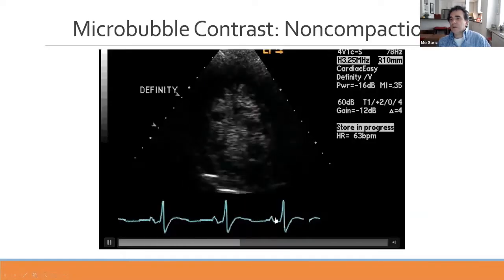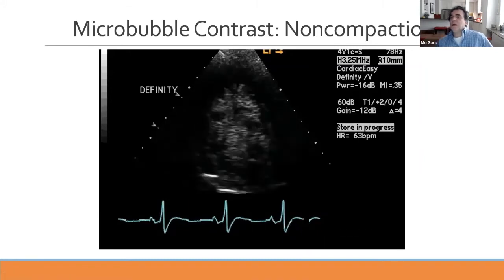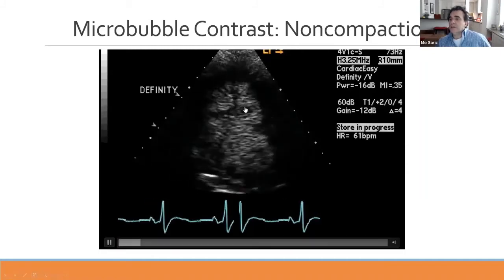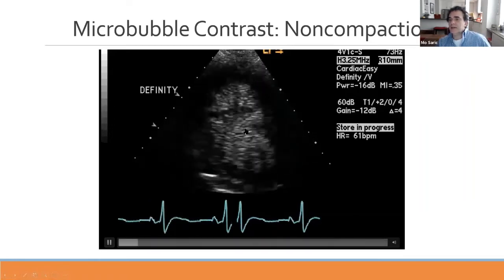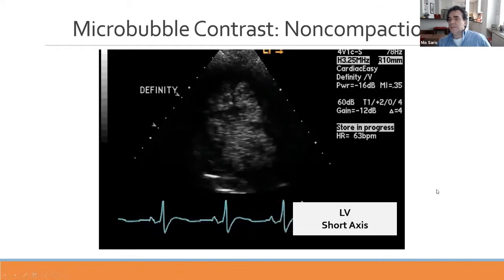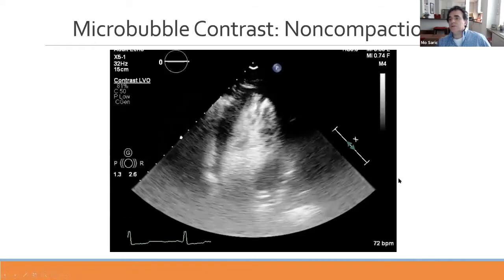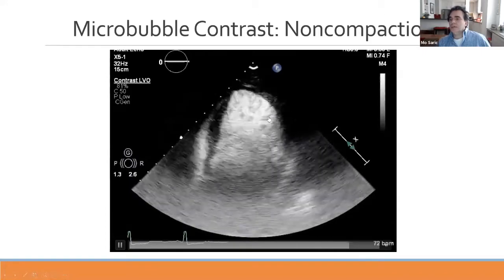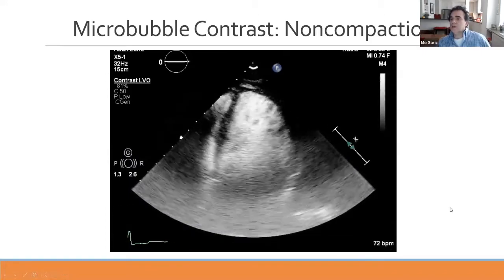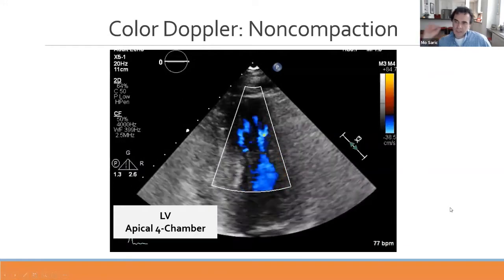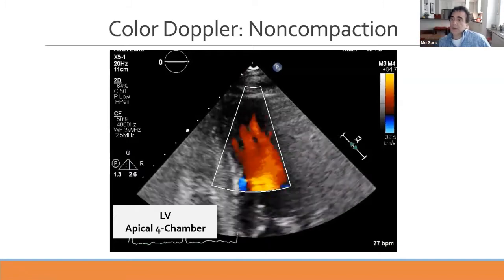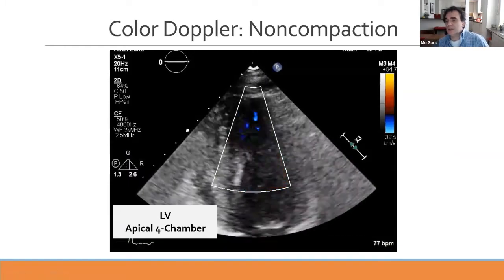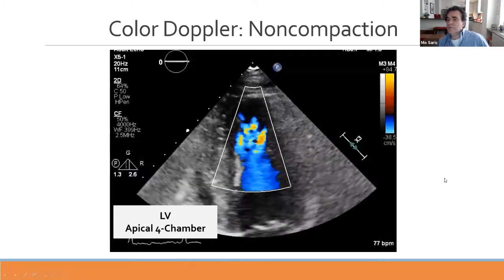Non-compaction is another condition where microbubble contrast or ultrasound enhancing agents help. Using Definity contrast in the short-axis view demonstrates extensive trabeculations inside the left ventricle characteristic of non-compaction. This is also seen in the long-axis and apical four-chamber views. Low-velocity color Doppler can show interstices between trabeculations, but the trabeculations themselves are best demonstrated by microbubble contrast.